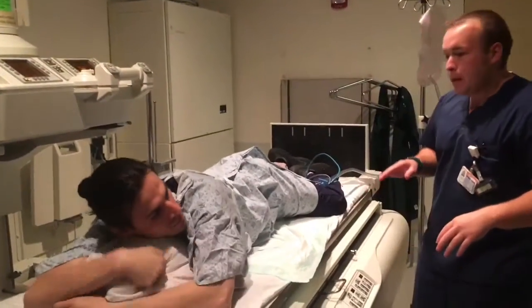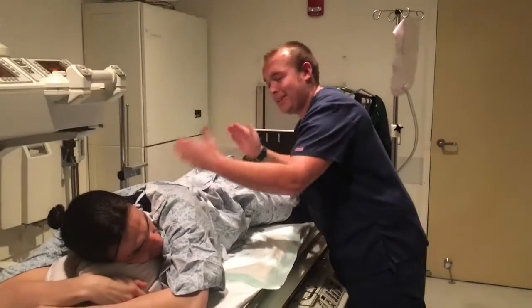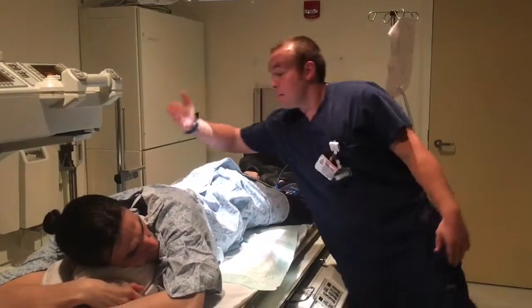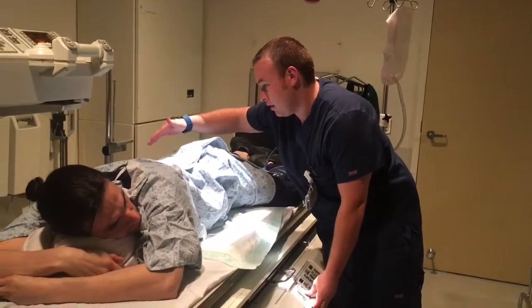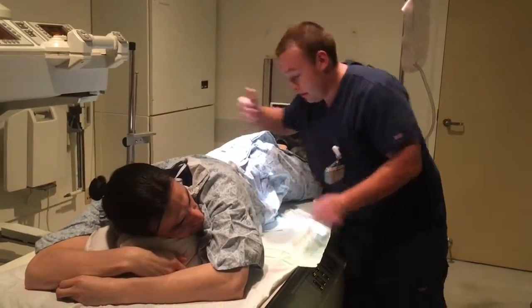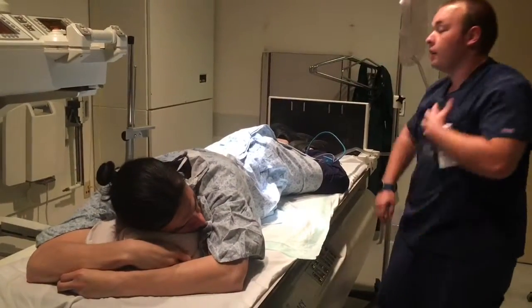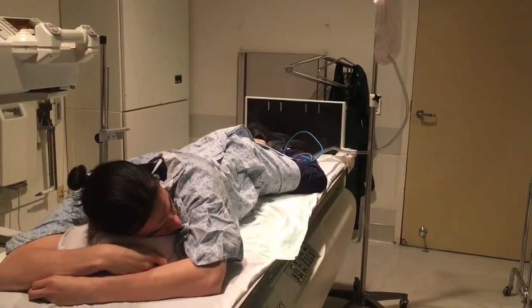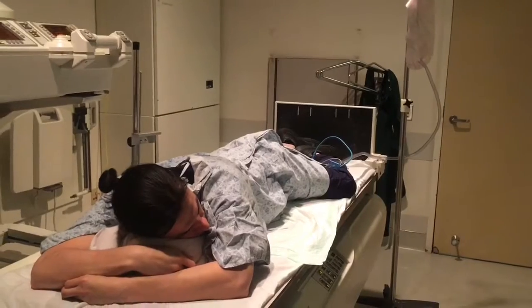And you guys may be wondering why I'm not shielding. Can't really shield on the male during these images because we're getting all of this right here. So I'm just throwing that out there for you guys. We're going to center basically mid-sagittal, but we're going to go 2 inches to the elevated side, still at the iliac crest. And make sure my marker's on there. I'm going to keep my same technique. Taking a deep breath. Blow out. Hold, X-ray, breathe.